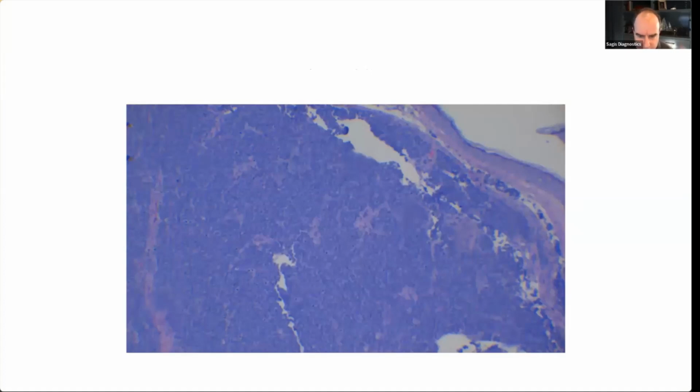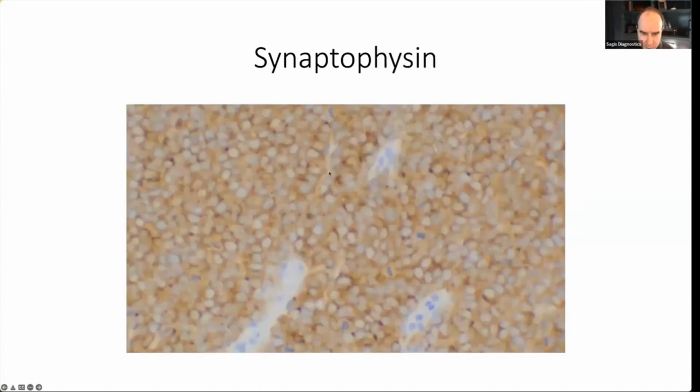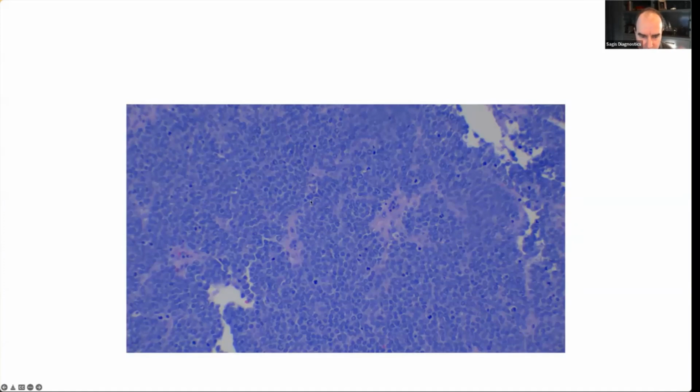Okay, so we have another big, large blue cell tumor. We're trying to figure out what all these are, because we just have these nondescript large cells here, but this has salt and pepper chromatin in them. See this right here? I'm using some keywords here. So we would throw on B cell, T cell markers, but we could save some money and make a guess. And this very well could be a neuroendocrine differentiation given our salt and pepper chromatin.